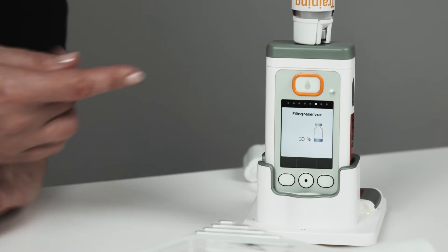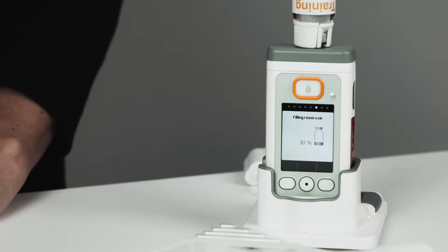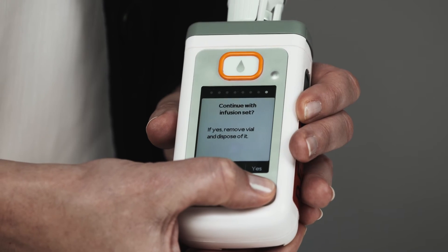The pump will now transfer the medication from the vial into the reservoir, which takes approximately six minutes. Make sure the docking station is connected to the power supply throughout this time. You can monitor the progress on the display. When the reservoir is finished filling, you will hear a beep and the display will say 100% filled. The pump will ask if you want to continue with the infusion line, so press yes.